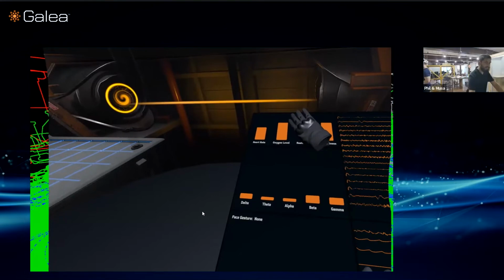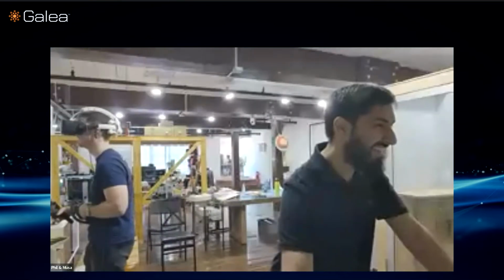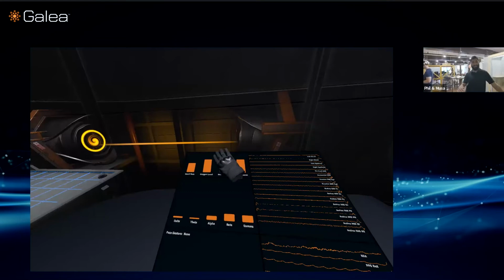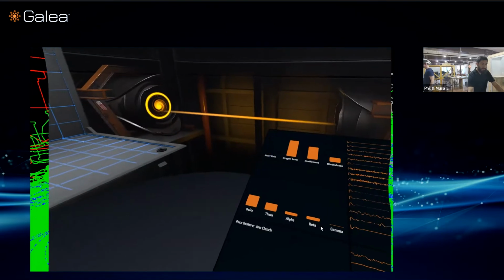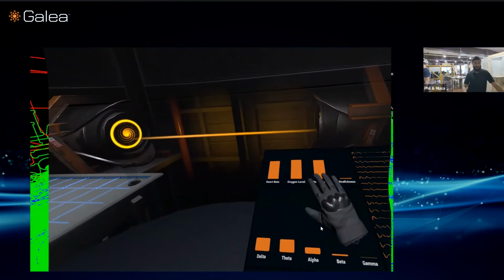Let me restart it. Really quickly, I want to point out, this is a Zoom issue where it'll start off smoothly and then the frame rate will drop after a while. I don't know what causes the issue, but it looks a lot better now. So yeah, you can see the heart rate and oxygen level went back up.